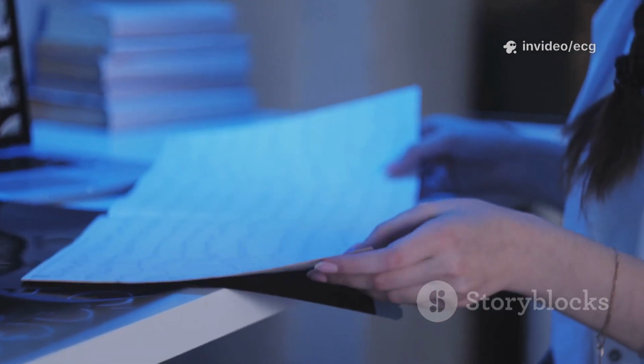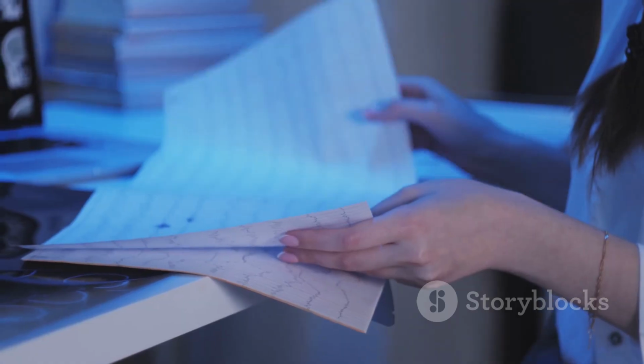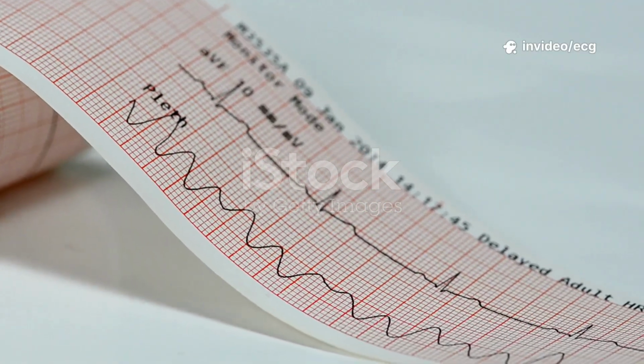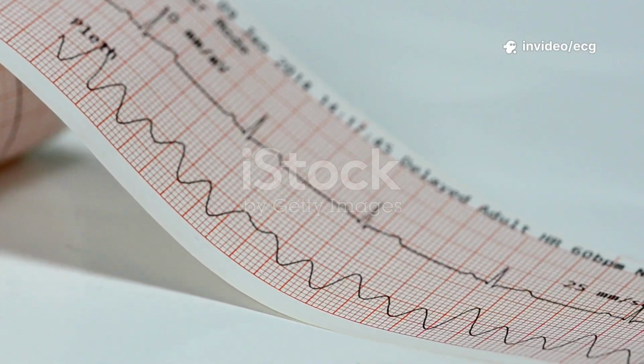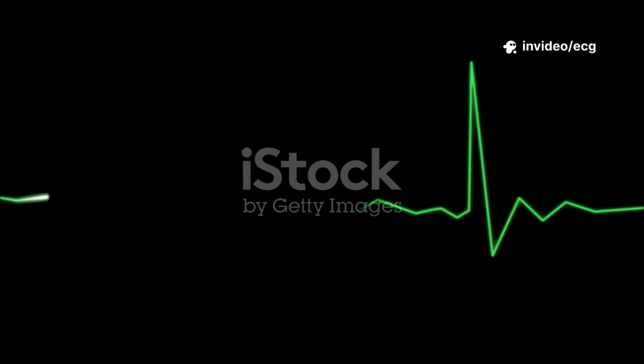If yes, and P waves look normal, likely normal sinus rhythm. Once you have your 10-step system down, you can start to recognize specific patterns. Learning the key signature of common rhythms is a great place to start. Montage: atrial fibrillation, atrial flutter, supraventricular tachycardia, and ventricular tachycardia.